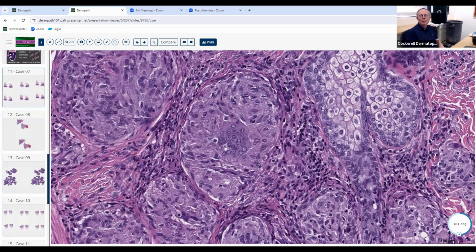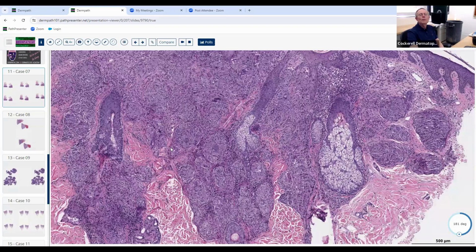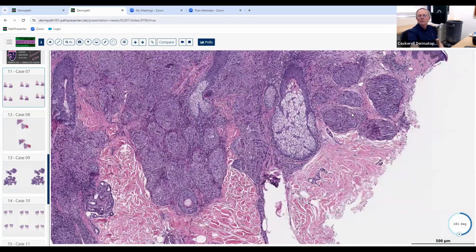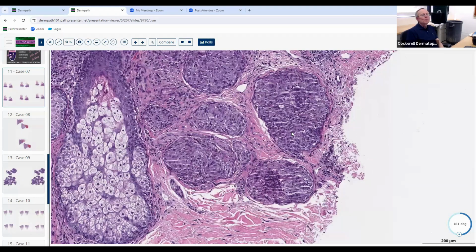They're going to expect you to be able to recognize that pretty quickly, and so they're going to ask you what the differential diagnosis of something like this is. I'm not sure they would expect you to look at this and tell you immediately the differential, that you could tell this from, say, a sarcoidal foreign body granulomatous dermatitis. That really wouldn't be fair.